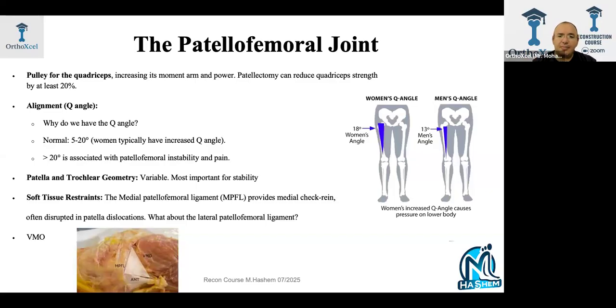You need to medialize your patellar button, and every time you medialize the button, you lateralize the patella itself, so the button will sit inside the new artificial trochlea and the risk of dislocation is less. You need to save your MPFL, because it is one of the primary restraints to avoid lateral patellar subluxation or dislocation. You need proper VMO strengthening exercises pre- and post-operatively to maintain normal tracking. You also need proper rotation of the femoral and tibial components to be sure the patella is centralized or medialized.